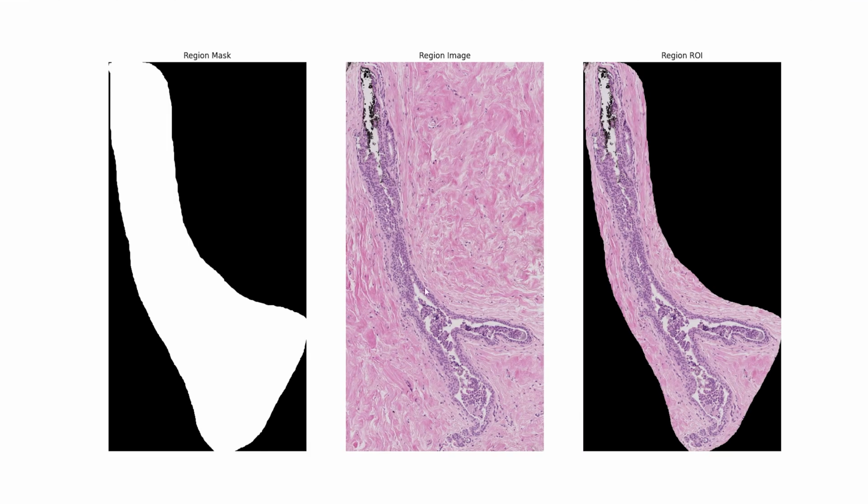As you see, this is the image as a rectangle region. This is the mask, and the mask reflects that white means included and black means excluded. So simply, if you remember, the region was surrounding that portion, which is reflected by the mask. But now I don't need to deal with the whole image or the whole region in this rectangle. I need only the elements or the tiles inside the region, which is categorized as benign, as I don't know what is the category of the outside region. So simply I will apply bitwise AND to obtain the region ROI or region of interest.